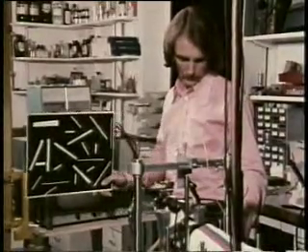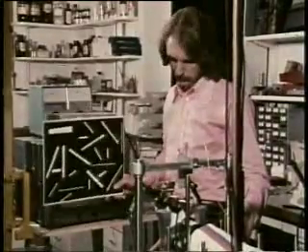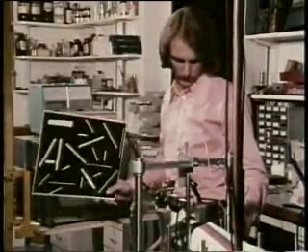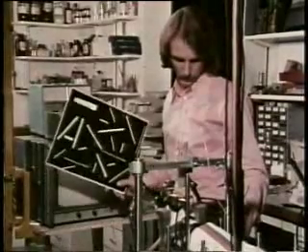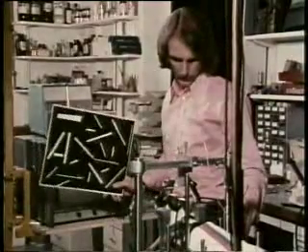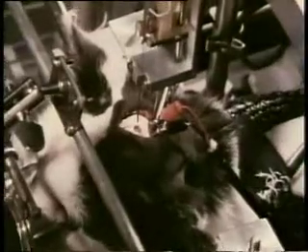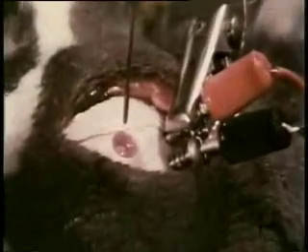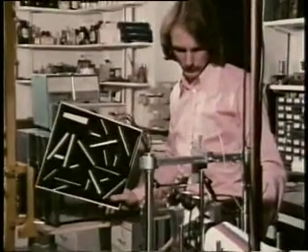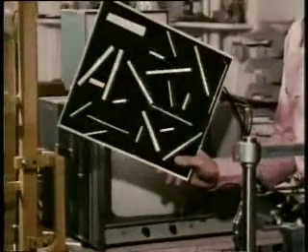As I move the electrode in, I'm waving a pattern of lines in front of the cat's eye to help me find visually responsive neurons. Compared with retinal ganglion cells, cortical cells have rather little spontaneous activity. What you heard was some action potentials growing out of the background noise as the electrode approached a cortical cell. This neuron clearly responds to something on the patterned card.